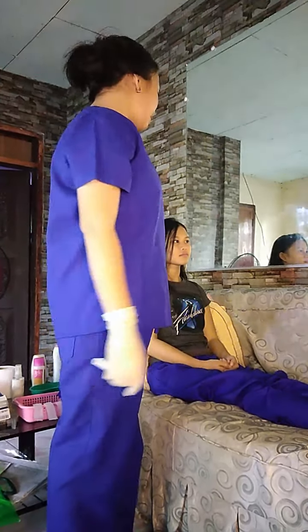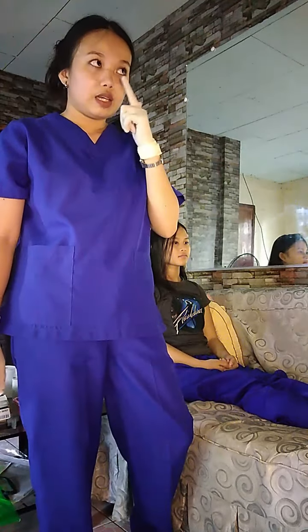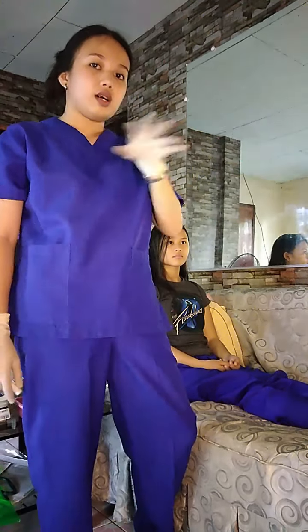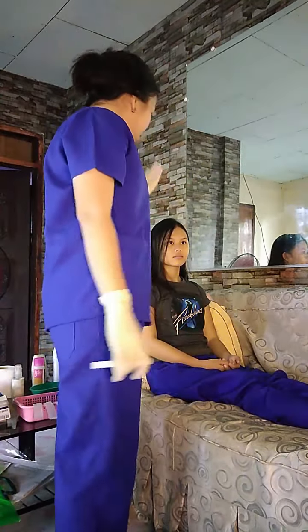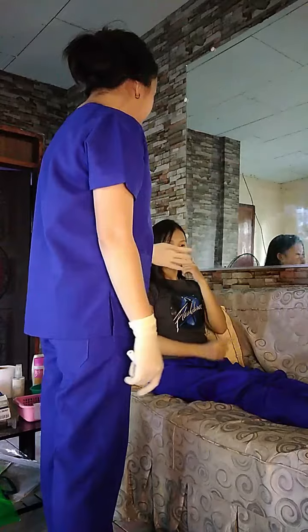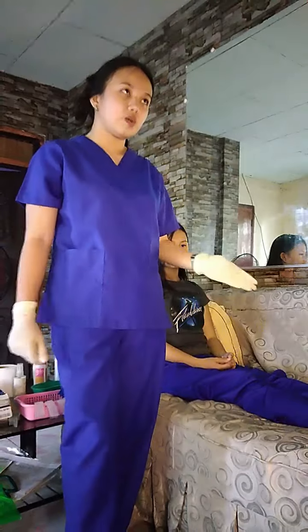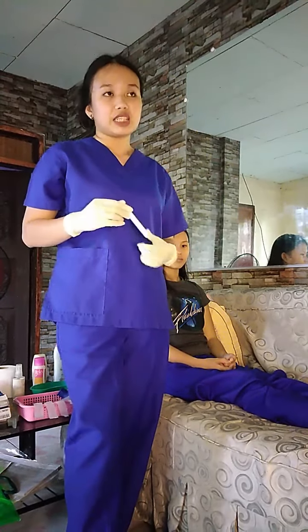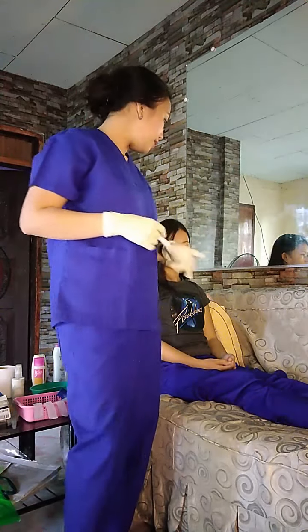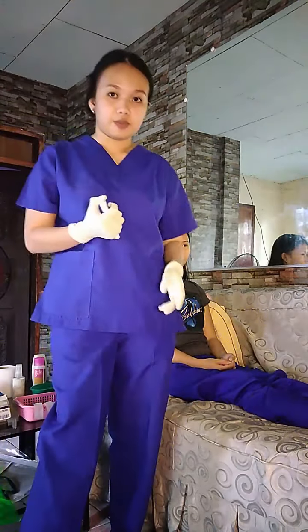So, pagkatapos kong i-check, i-ask ko yung patient kung pwede niyang i-pinch yung kabilang nostril niya and then blow sa kabila, and then vice versa. So, ma'am, maaari niyo po bang i-pinch or diinan and then blow po? Okay, so other side po. Okay, thank you so much. So, ang pinili ko, since wala namang obstruction or deformities na na-observe, and parehas naman na maganda yung blow ng air sa both nostrils, ang pinili ko is yung pinakang convenient sa akin, which is the right nostril.